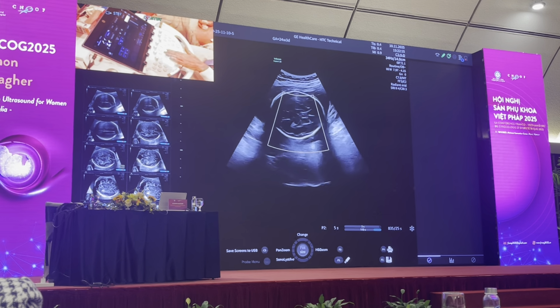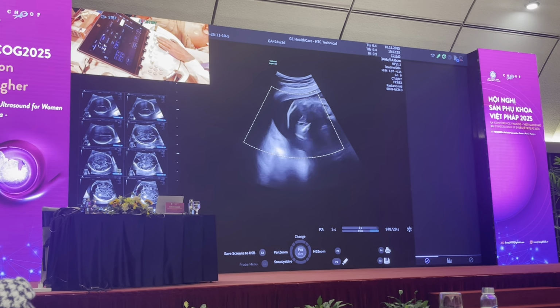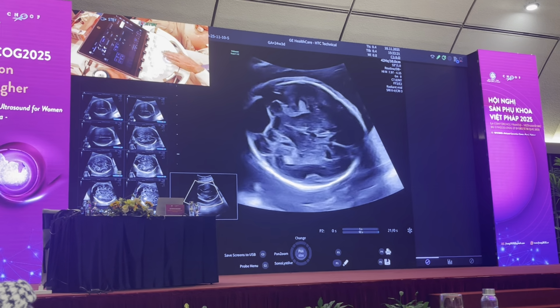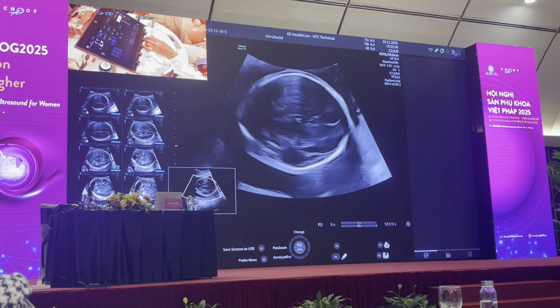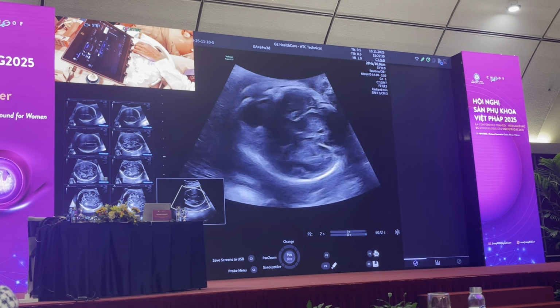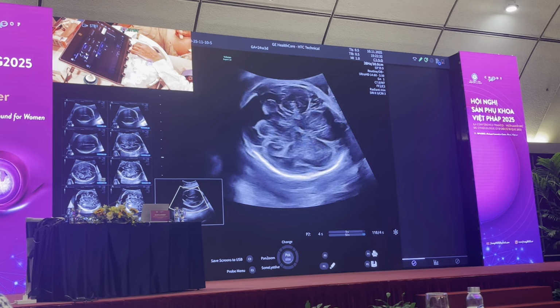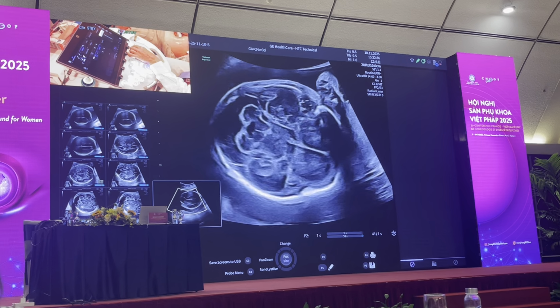And I'll see also if I can try and get the baby inside of the section, which we were trying to say. Let me finish with axial evaluation. So as I come across in the axial evaluation, I'm going to move to a high frequency 7 probe. And I want to look at any signs of cytomegalovirus infection.